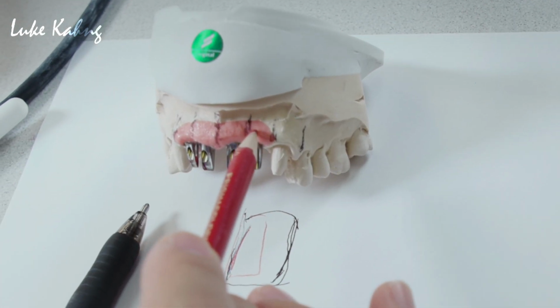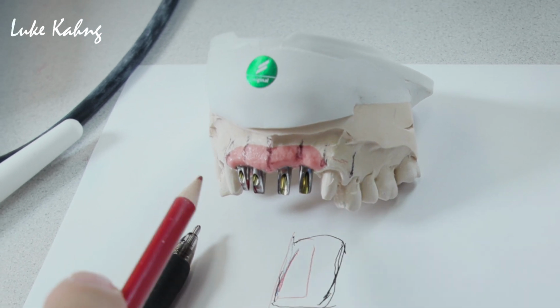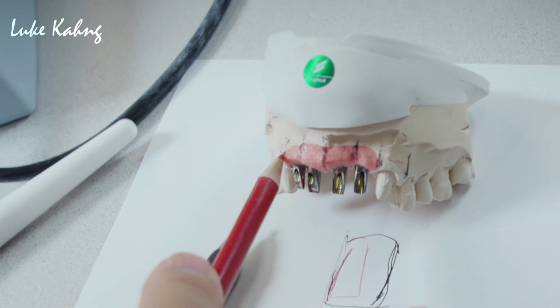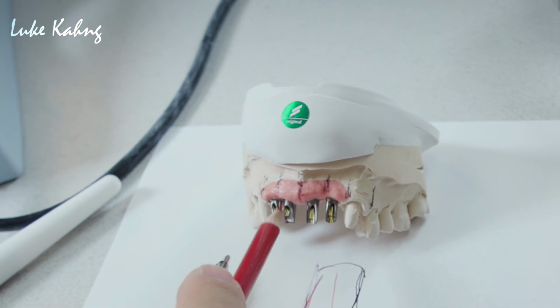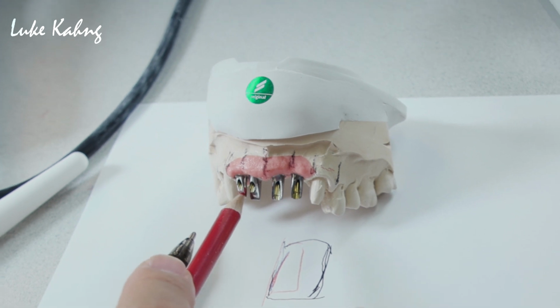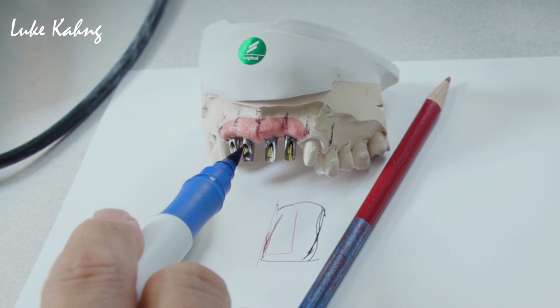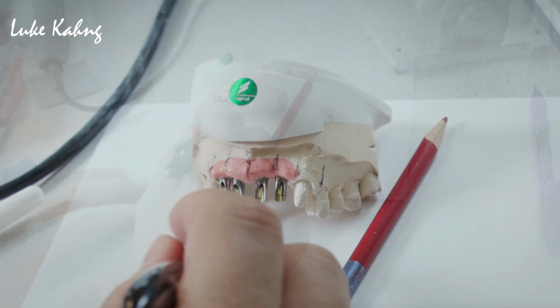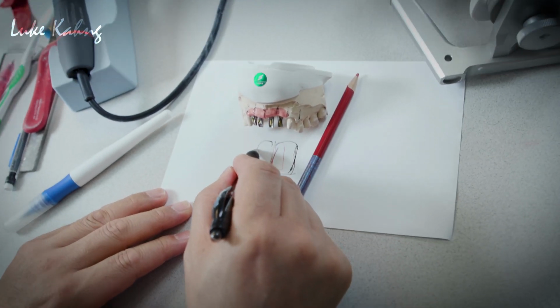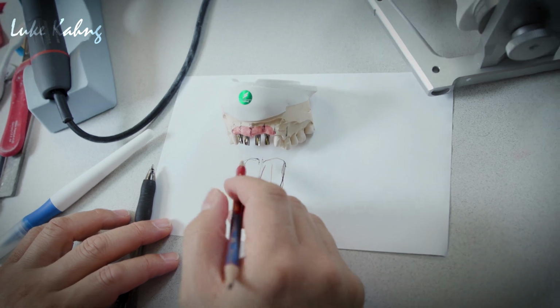So here is the central, here is the lateral, here is the canine, so I have to move it, and then I have to make another canine too. Here is my guideline. First, draw the guideline. So when you draw here from midline, it's too close. So they must grind here, move it. Then I can make the better central here.